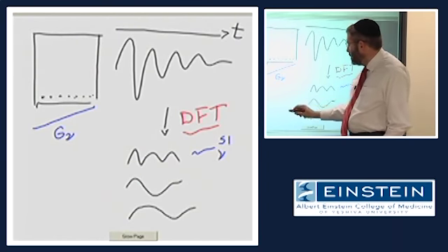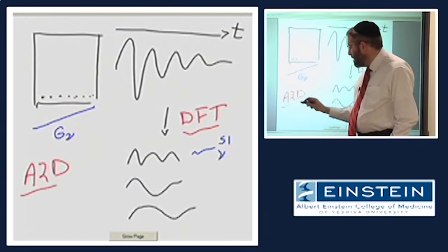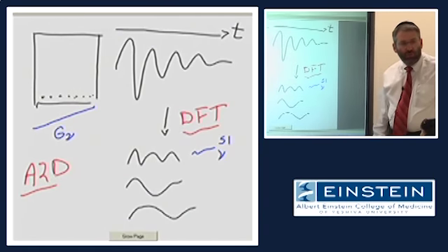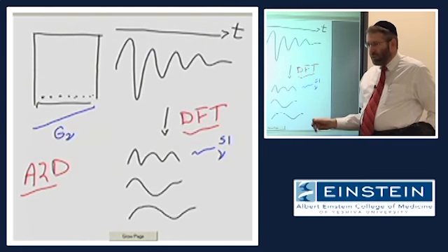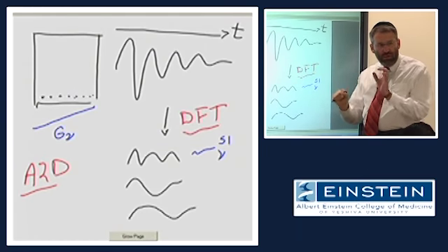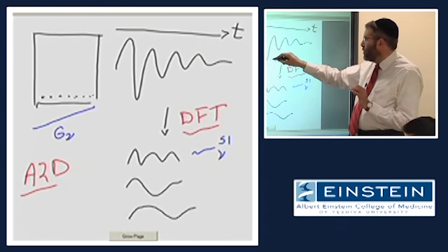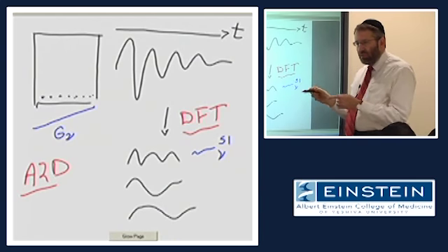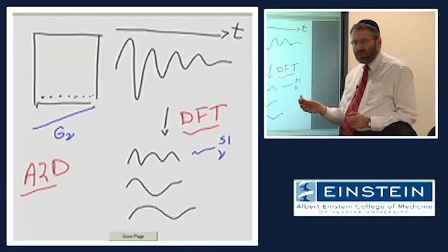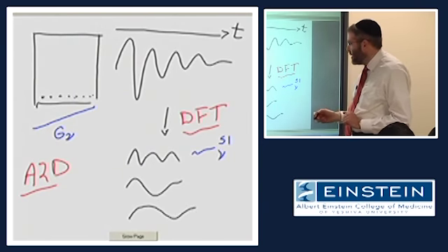Now, this has to do with the piece of hardware that we talked about yesterday, that is the analog to digital converter. So the signal, right, if we simply hooked a little plotter up to the voltmeter on our receiver coil, we could actually record the MR signal as a continuous analog signal, because that transverse magnetization is continually precessing in the transverse plane. Right?